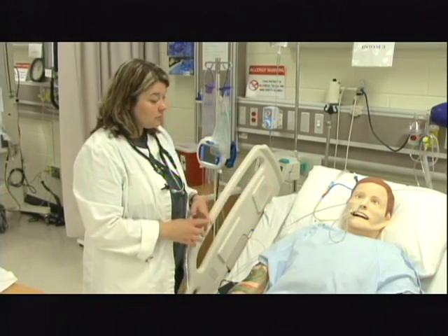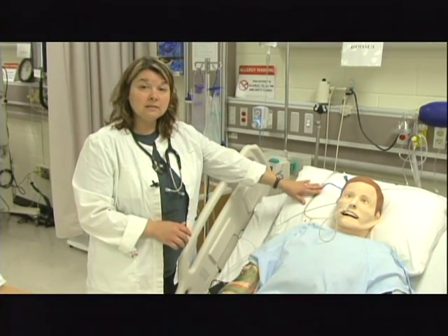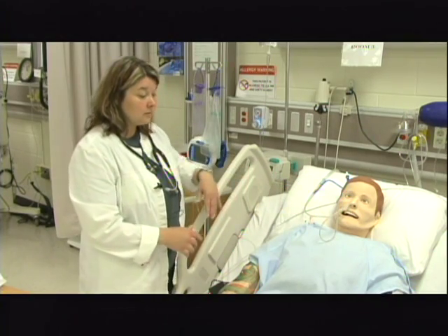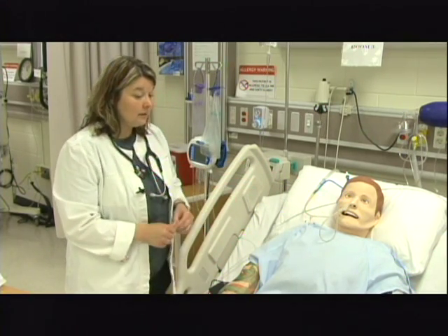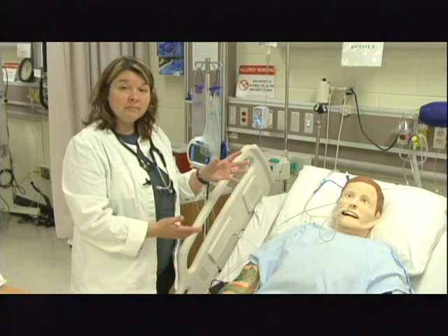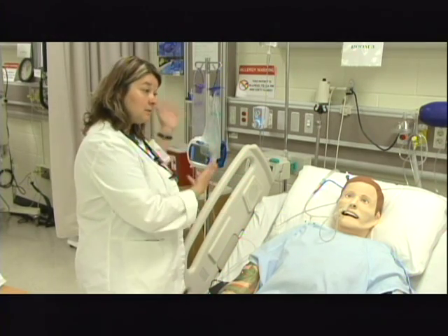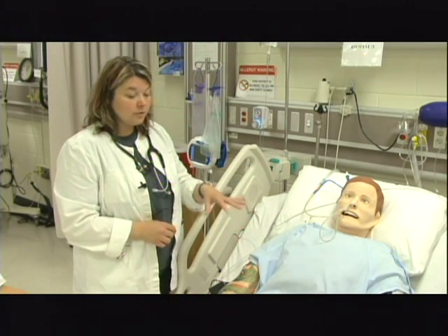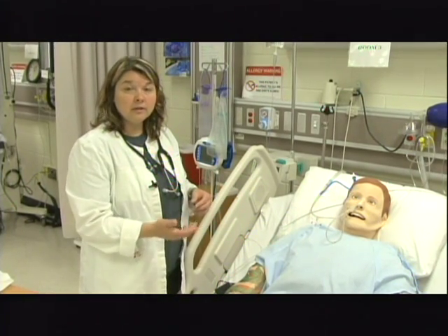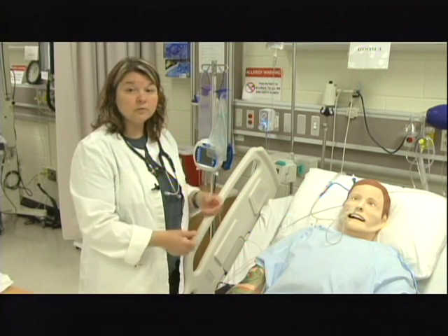Since you've got the NG tube in, I've already listened to your bowel sounds and all of that stuff. Certainly I need to listen to bowel sounds with the suction off, as we discussed in the last video, because otherwise I would hear only the suction. I need to let him know that I'm going to turn his suction off while I'm giving him the medications, obviously, because if I don't, then the suction's just going to suck the medicines right back out. Also, once you give the medications, you need to leave the suction off for a minimum of 30 to 45 minutes so that it doesn't suck the medicines right back out and you allow for absorption.